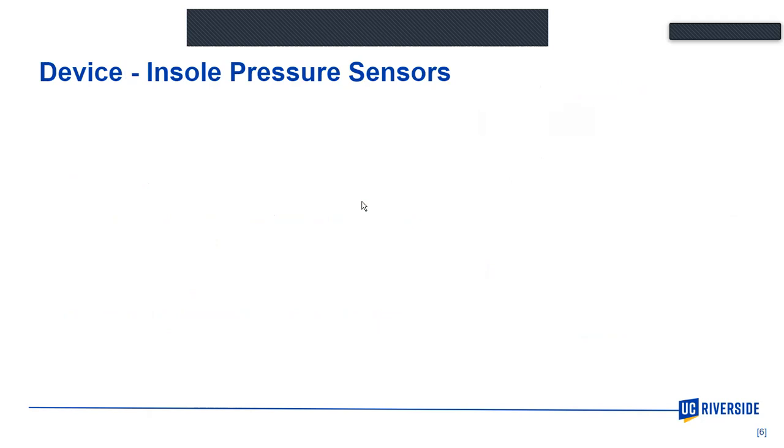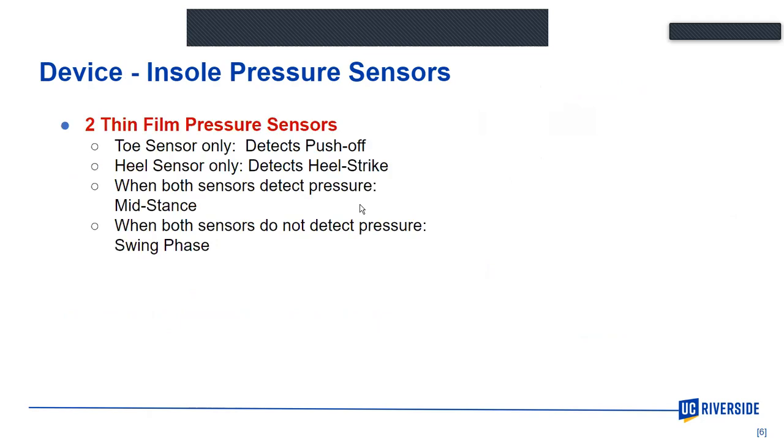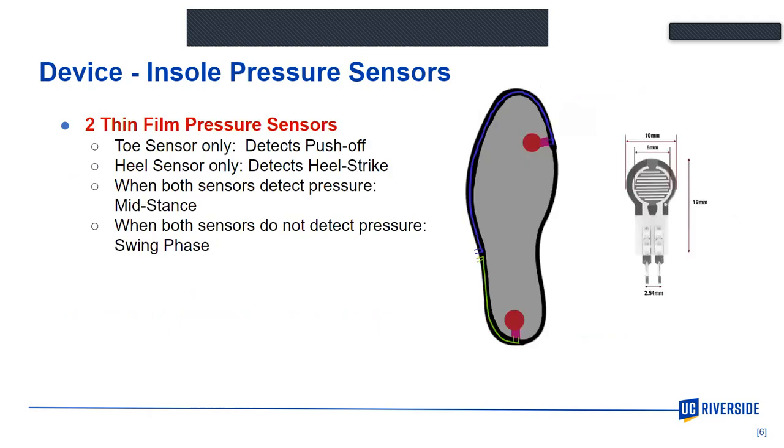When designing the pressure sensor component of our device, we had to consider the amount of pressure sensors needed to get an accurate pressure reading of the feet. At first, we only used one pressure sensor at the heel of the foot. However, we realized that this is not optimal to detect walking in children with CP because, 1, this population has a tendency of walking on their tippy toes, and 2, by using a sensor at the ball of the foot, we can detect push-off, whereas the heel sensor can only detect heel strike.